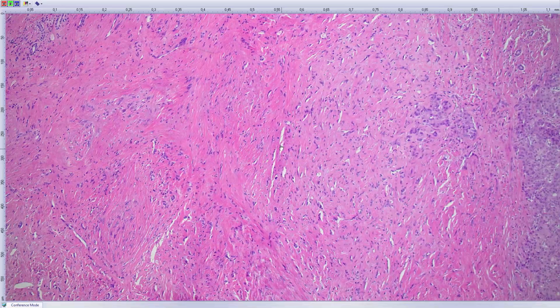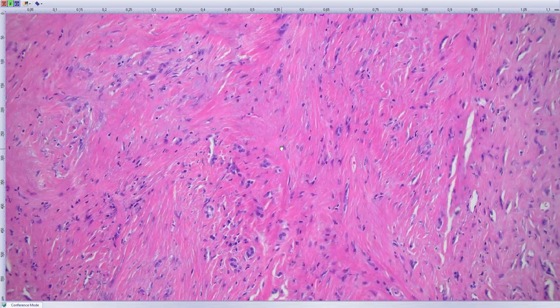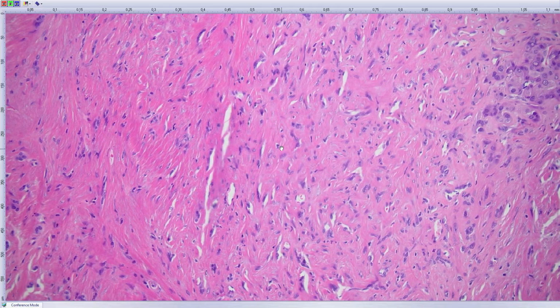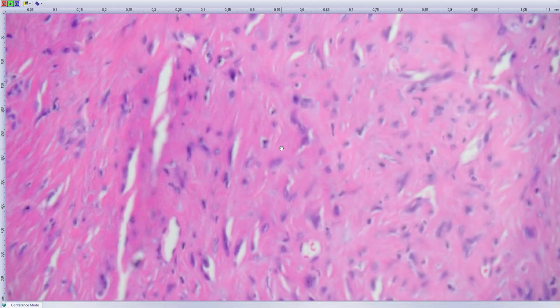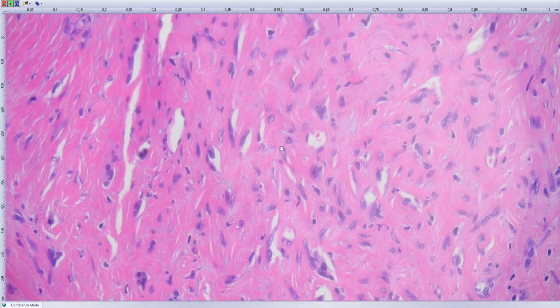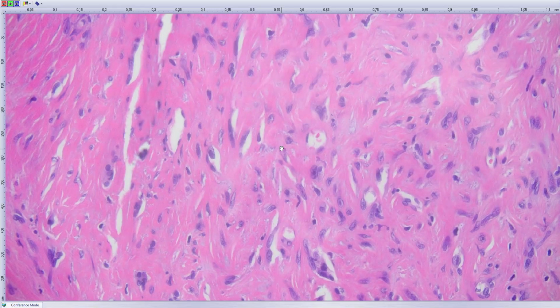But it's not all. You see around here something else. It looks like fibrosis or scar, but when you look at it more carefully, you will see that this scar-like tissue has cells that sometimes produce these intracellular lumina with erythrocyte inside of it. You can see one in the middle. And the surrounding of the tumor is epithelioid hemangioendothelioma, which was CAMTA1 translocated, and which is typical for these tumors. So the diagnosis in this case is well-differentiated hepatocellular carcinoma surrounded by low-grade sarcoma of epithelioid hemangioendothelioma.